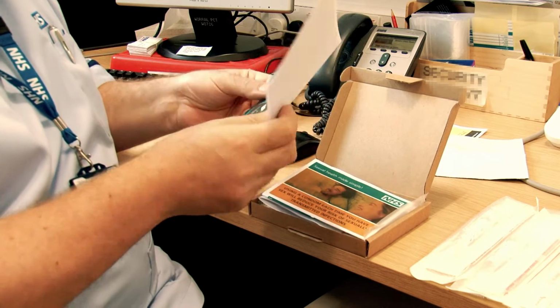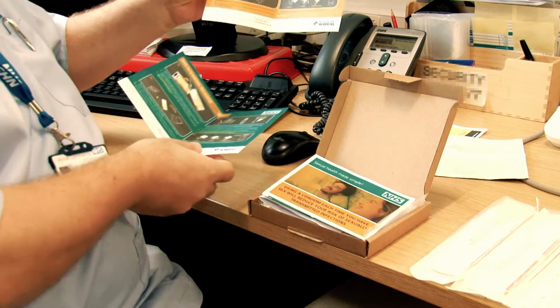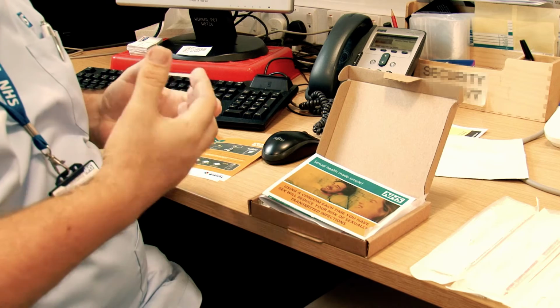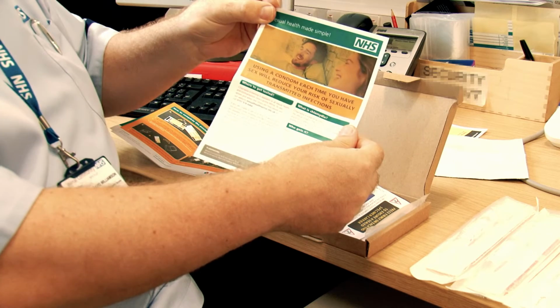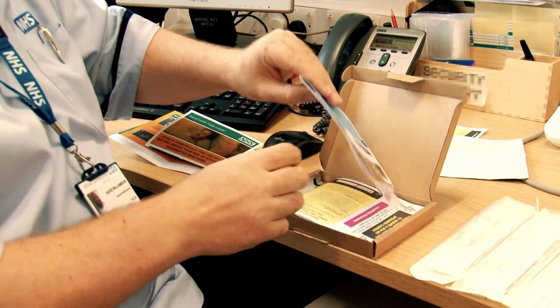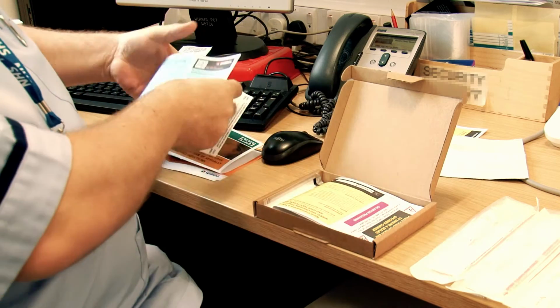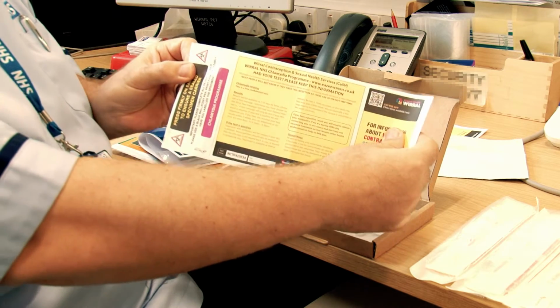If you order a swab test, you'll get the swab instructions. If you order the urine test, you'll get the urine test instructions. It's important to have these in front of you, I think, so that they're there for you as a prompt. You'll get a leaflet if you order condoms. This is about condom usage and how to use them. You'll get one of these forms, either a blue or a yellow, but you'll definitely have one of these forms in there. There's a blue one, and there's the yellow one.